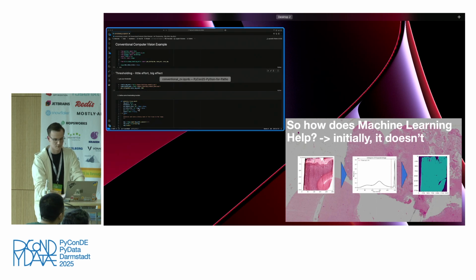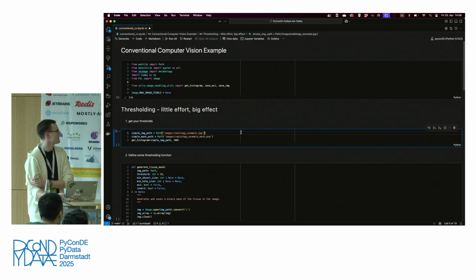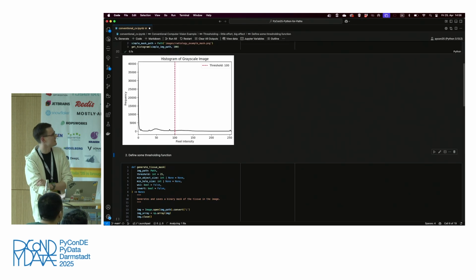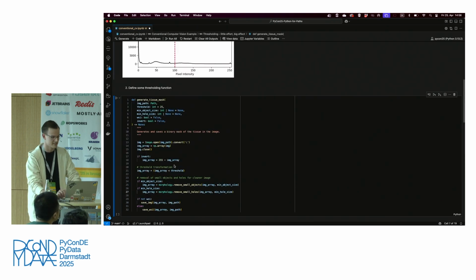As I still wanted to do anything practically, I prepared this very, very tiny example, which basically just reads in some images and generates this nice histogram. This is a radiology image. You can see it's way more confused than pathology. But to be honest, there is actually a quite clear syntax of which pixel range relates to which object in radiology, so we could do way more with thresholding in radiology.